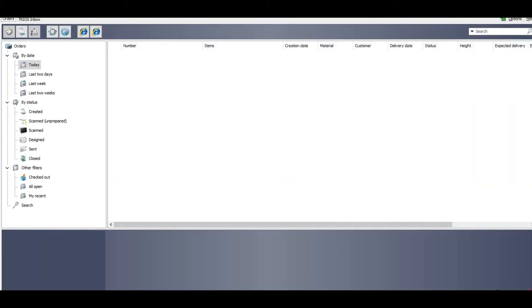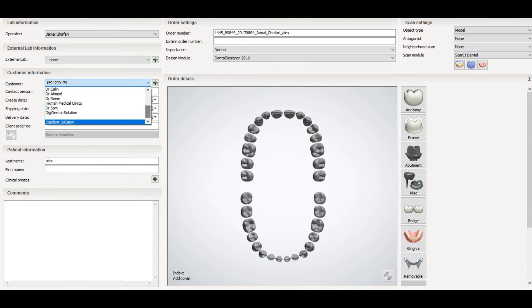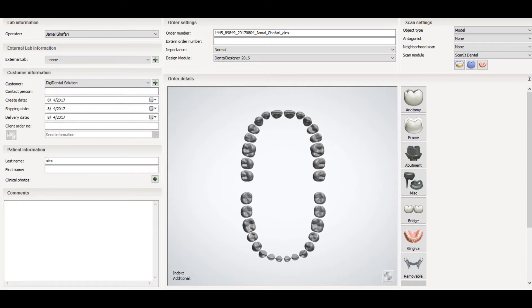Let's go to the manager and select New Order. In the patient information you can write down the patient name, and in the customer section you write the doctor's name. Here you can also write down the order number or the file number of the patient.